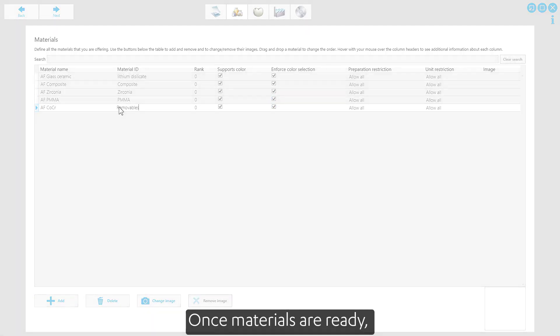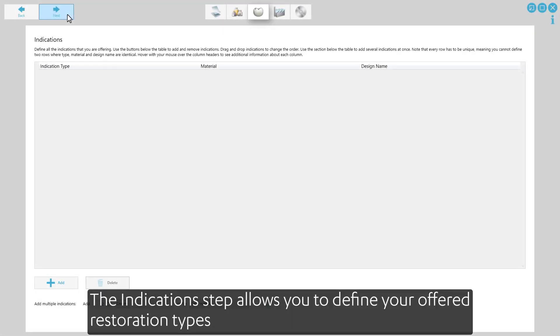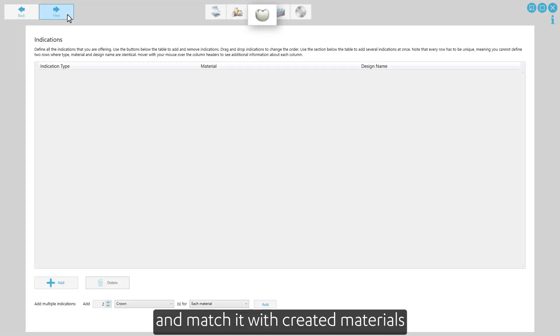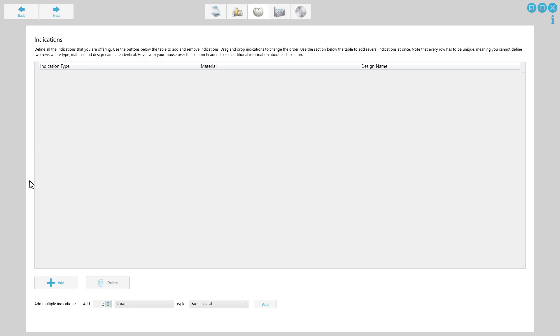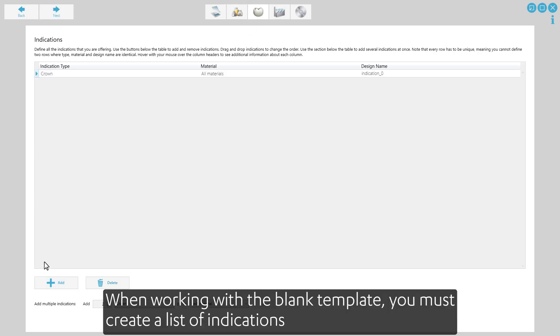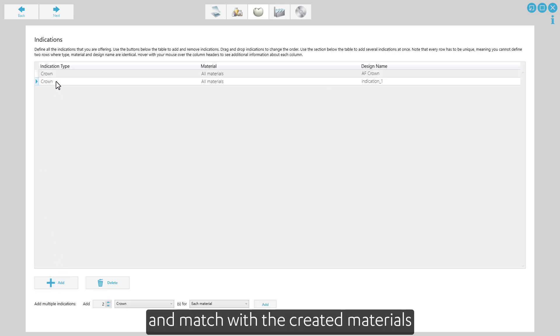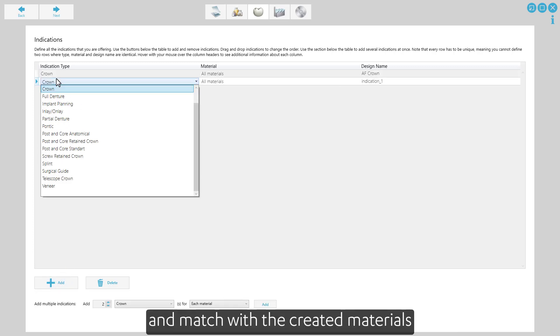Once materials are ready, the indication step allows you to define your offered restoration types and match them with created materials. When working with a blank template, you must create a list of indications and match with the created materials.